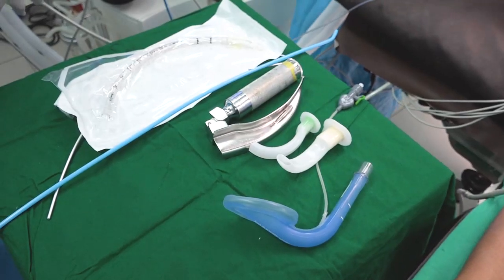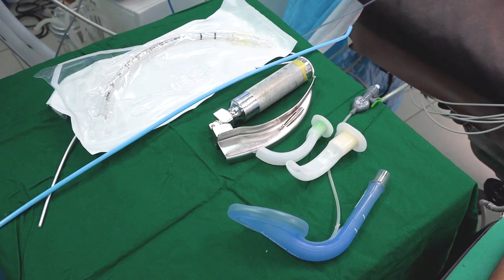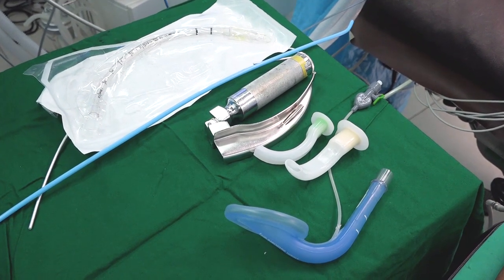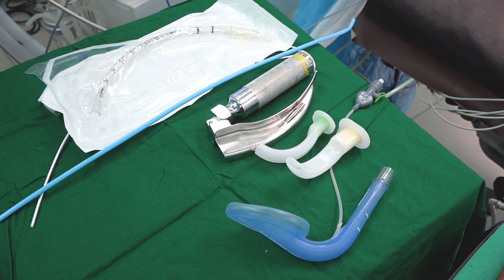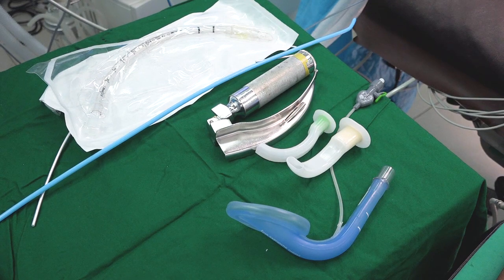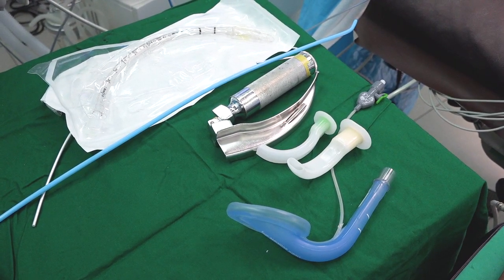By now you should be ready with the correct size endotracheal tube and a tube one size smaller, correct size laryngoscope blade, endotracheal tubes, stylets, bougies, and laryngeal mask airways and oropharyngeal airways to be used if necessary, and also a suction in working order.